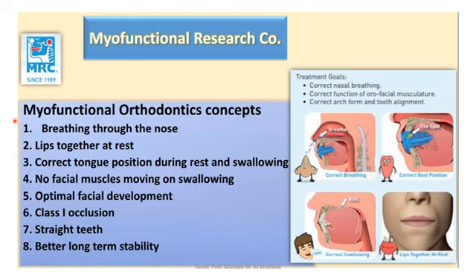The Myofunctional Research Company's treatment goals: correct the nasal breathing, correct the functional orofacial musculature position, correct arch form and tooth alignment, and produce lips together at rest and correct swallowing behavior.